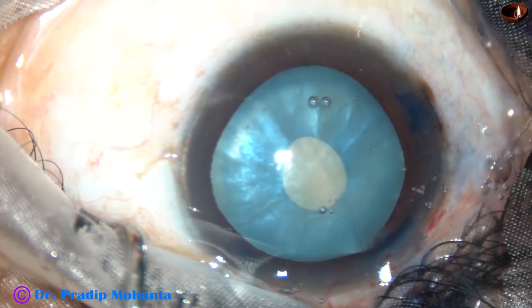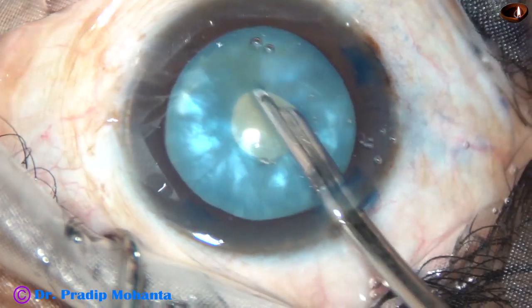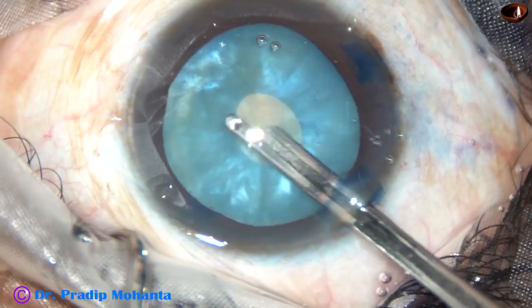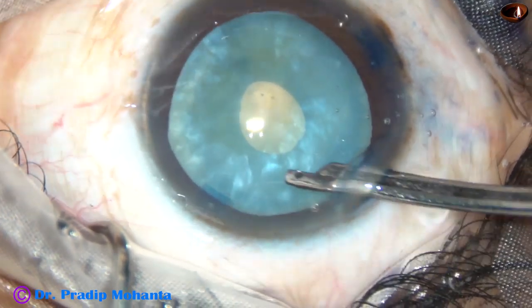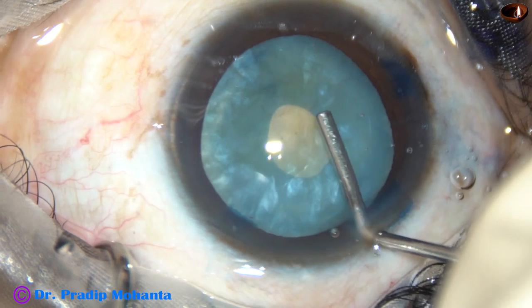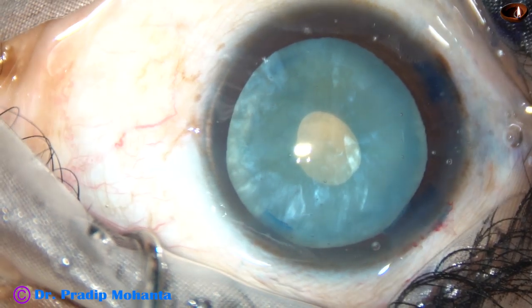I use a Simcoe cannula — a 23G Simcoe cannula — to aspirate some lens matter and some cortical matter. This manoeuvre drastically reduces the intralenticular pressure. Then 2% HPMC is injected again.